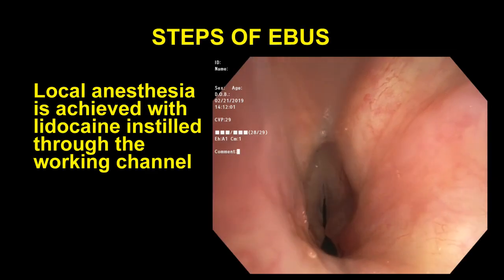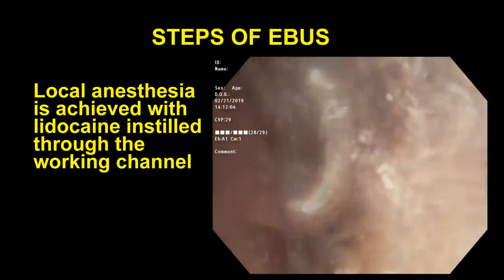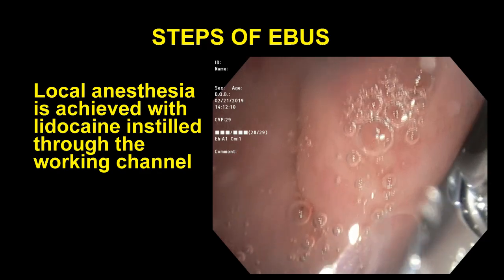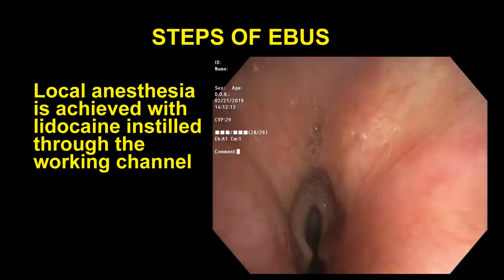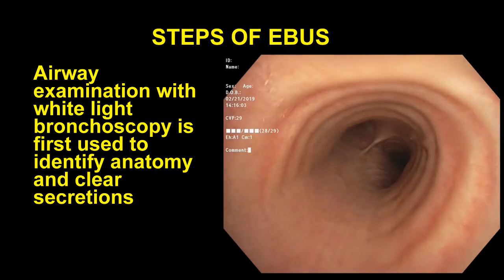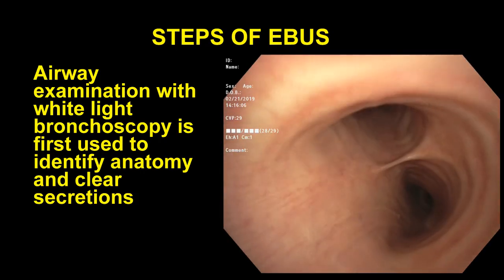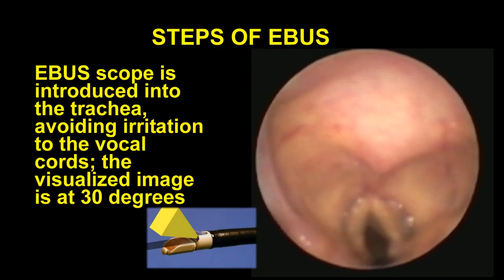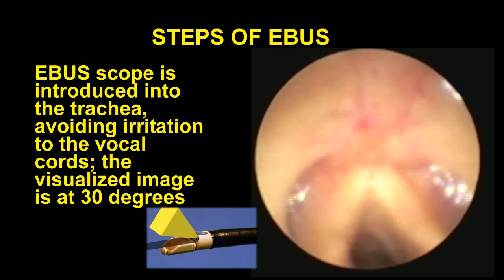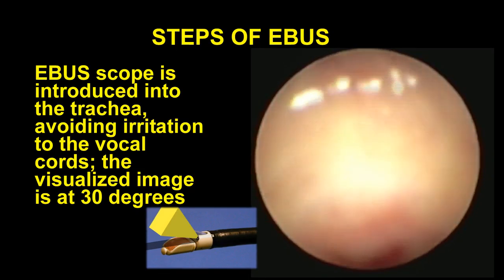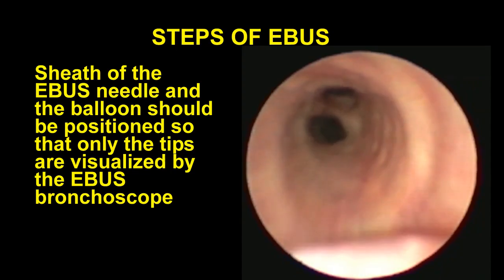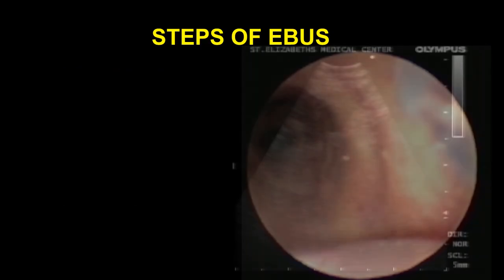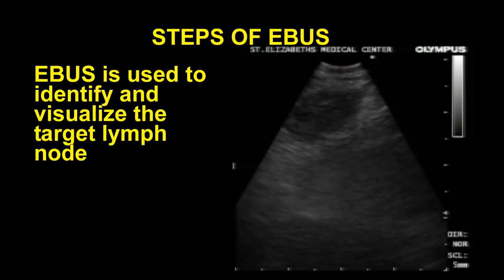White light bronchoscopy is first performed. Local anesthesia is achieved with lidocaine instilled through the working channel at the level of the vocal cords, main carina, and the right and left secondary carina. An airway examination is performed to identify anatomy and to clear secretions. The EBUS scope is then introduced into the trachea, avoiding irritation to the vocal cords. The visualized image is a 30-degree view with the Olympus scope. The sheath of the EBUS needle and the balloon should be positioned so that only the tips are visualized by the EBUS bronchoscope. The EBUS scope is then used to identify and visualize the target lymph node.